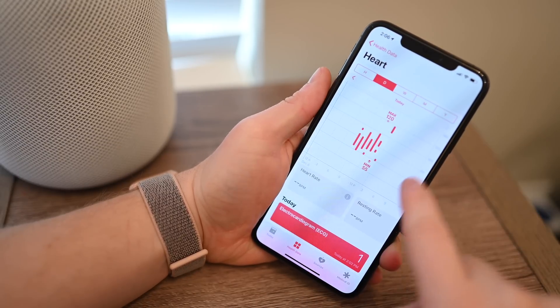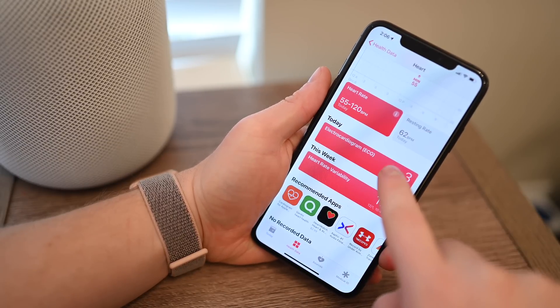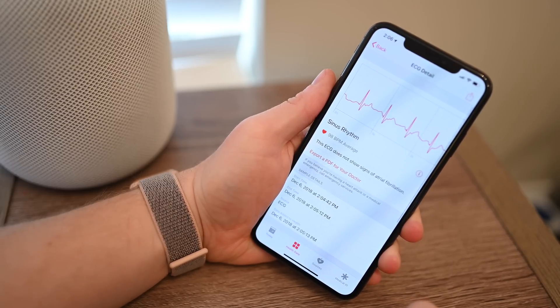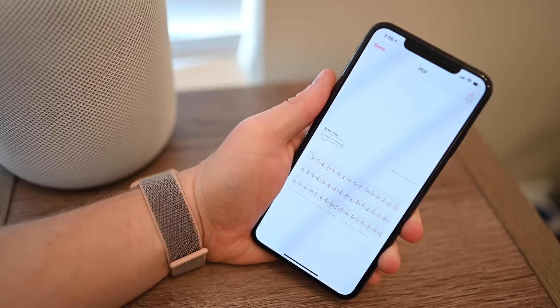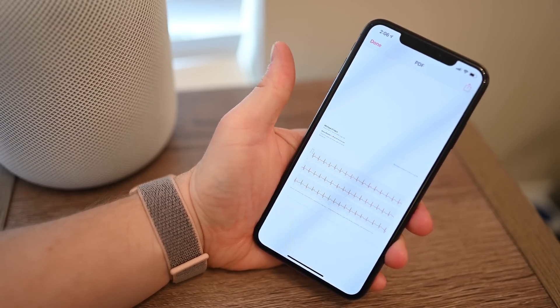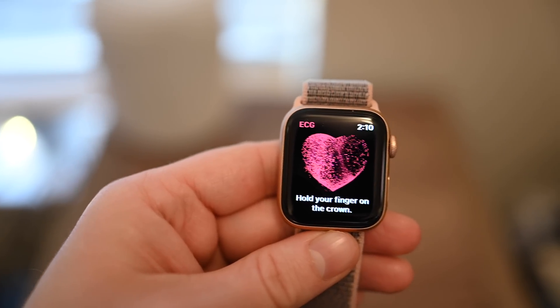Choose any of the tests that you ran to get a bit more information on it, and there is a button that says Share via PDF. Tapping that PDF icon allows you to generate the PDF, save it into Files, save it to an email, or whatever it may be, to export it out of the Health app and get it to the right person.